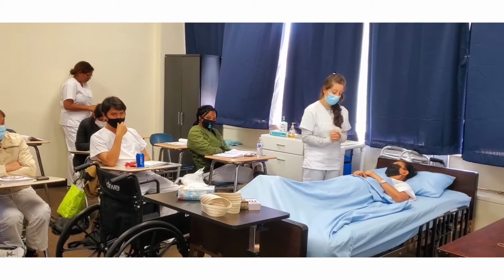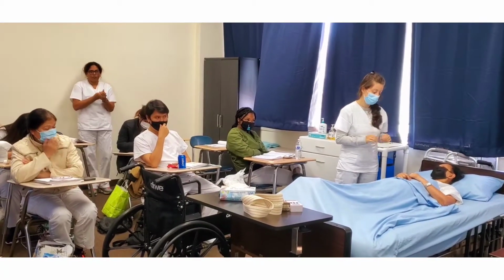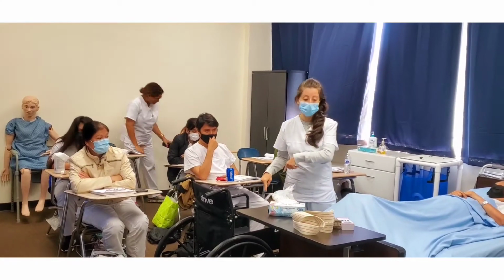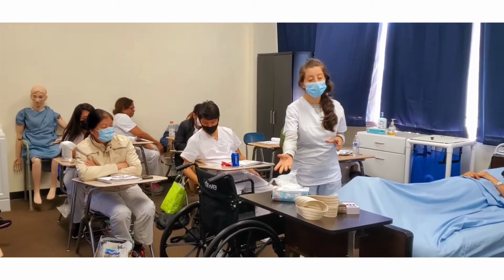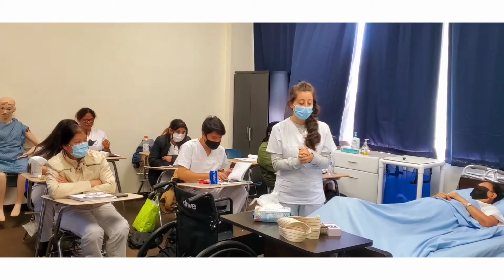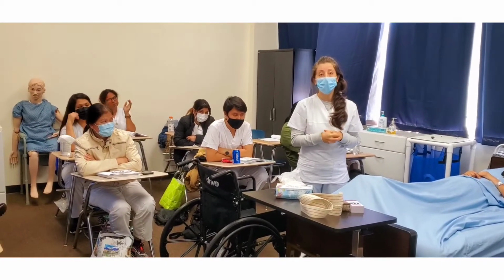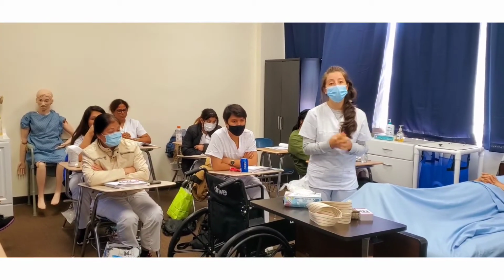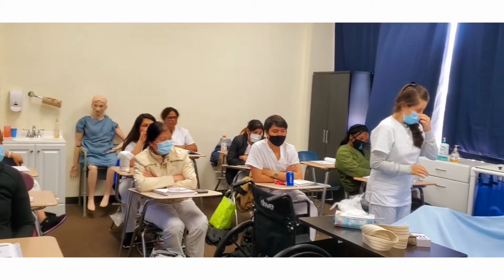Okay, great. So I'm going to wash my hands, gather my supplies, and I'll be right back. For this skill, you need a gait belt, a wheelchair, and if you want, you can use gloves. But I'm always going to wash my hands. That's very important. You always want to make sure the patient's shoes are non-skid, or at least her socks are non-skid, to prevent falls. No shoes with her at the moment for some reason.